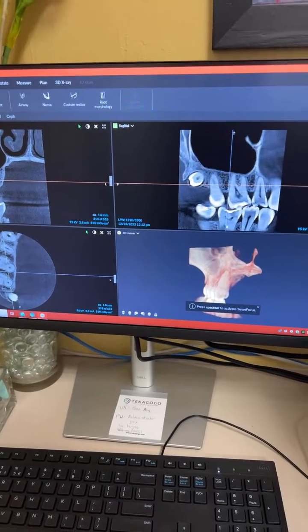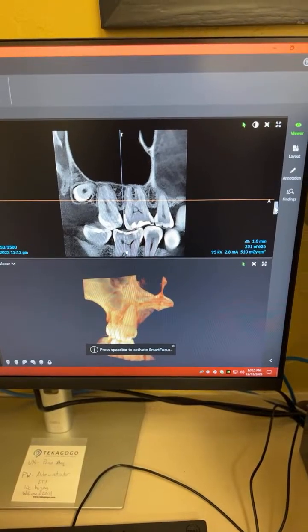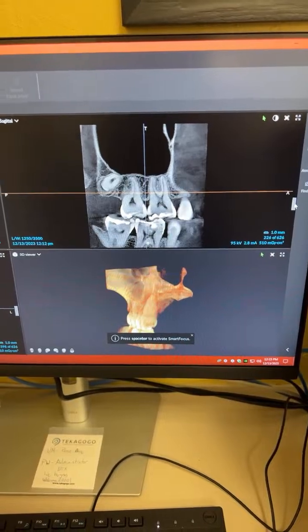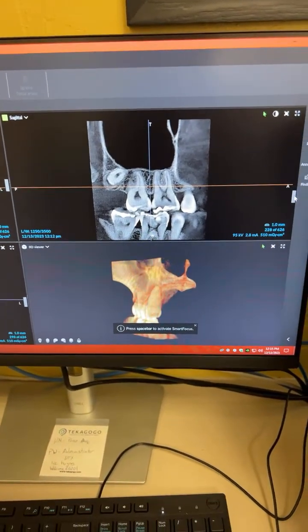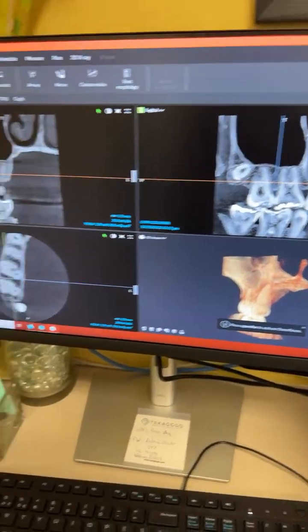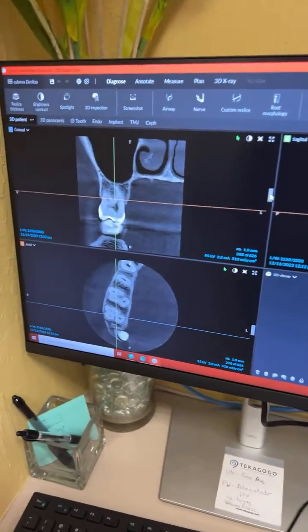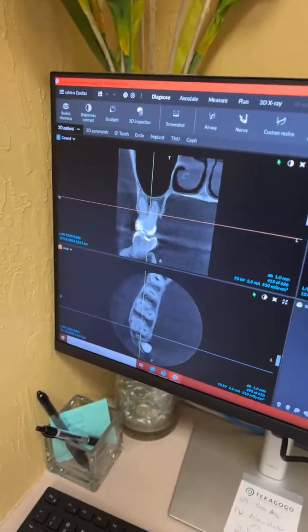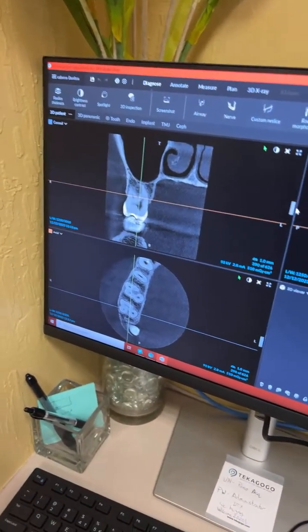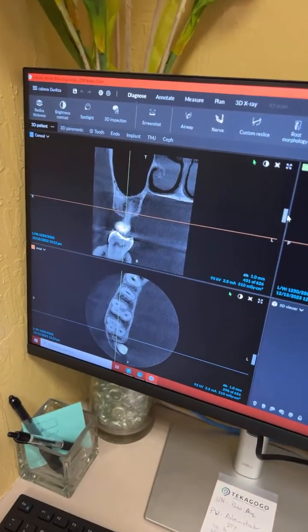Let me see, double click it. Okay, yeah, look at this. Look at that resolution. And you can always go back to adjust it? You can adjust the contrast, the brightness. You can change the occlusal plane. That's why before you check it, you do the review. You see that the review, and when you hit this review right here, this is also very cool to see where the sinus and the root are. But the review you can do more.